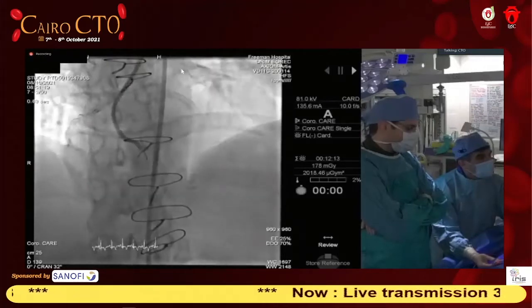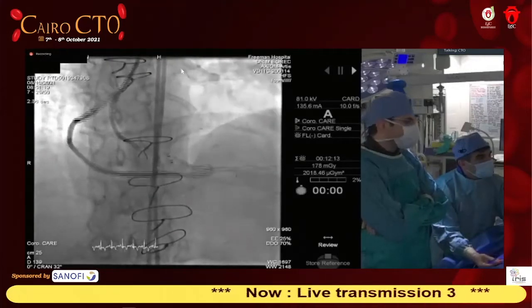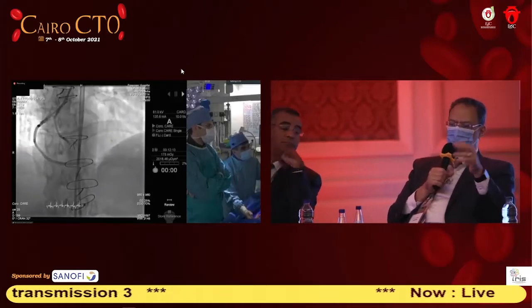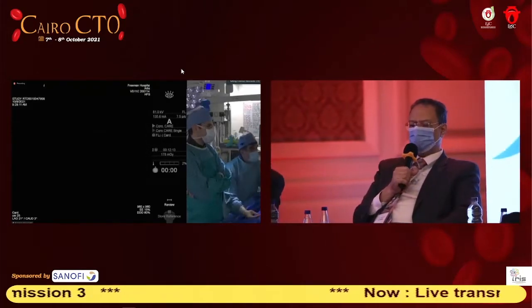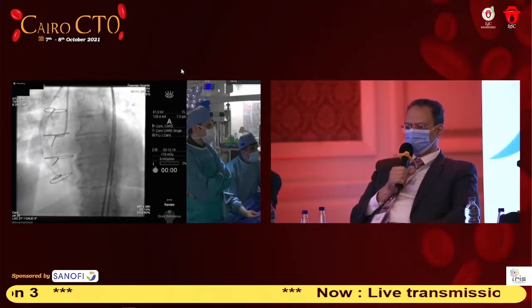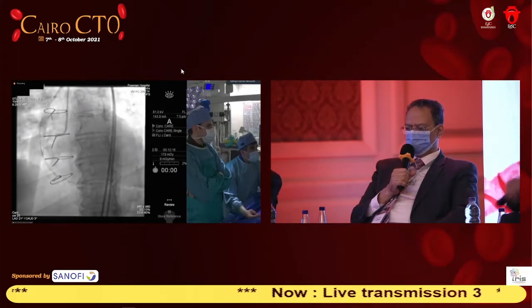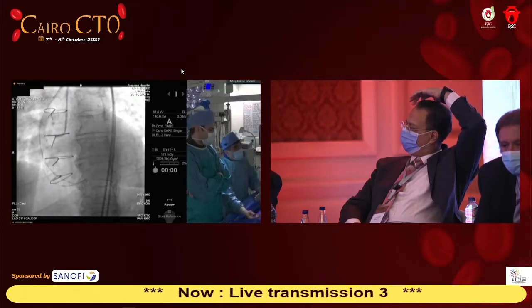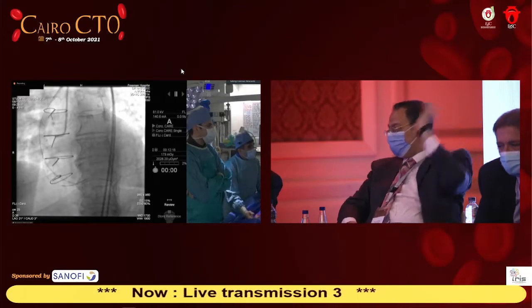Mohanad, the problem of this vein graft is that this graft is full of thrombi, as you do some aspiration. Well, this one doesn't have the thrombus. That was the vein graft to the OM that I was going to use as a retrograde approach to the PDA. In general, when they are diseased, quite often they will have thrombus. My wire has come back now. Anyway, so we managed to do this.